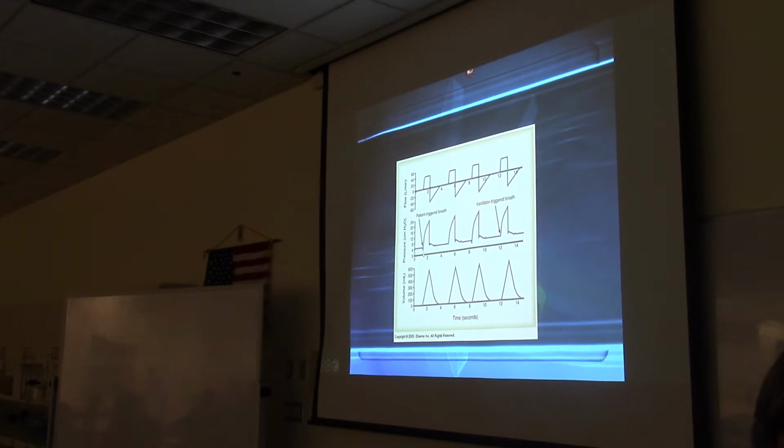All right, so the ventilator gives a breath to the patient. We see pressure building. And then when the pressure comes back down, that's exhalation. Can you line it up with the flow? So air is flowing into the lungs. It flows and flows and flows. Now the exhalation valve opens, and this becomes exhalation. So at this one point in time, inspiration ends, the exhalation valve opens, and now the air comes back out. And then the volume goes in, the volume comes back out.